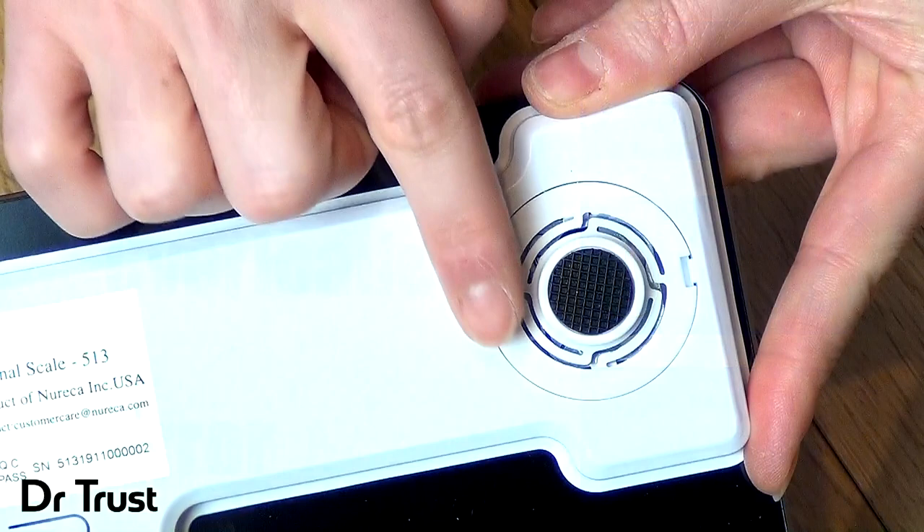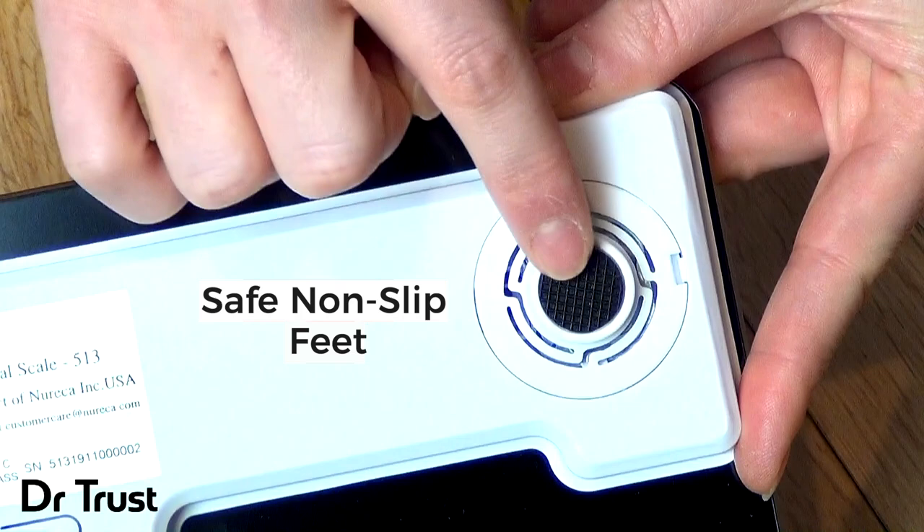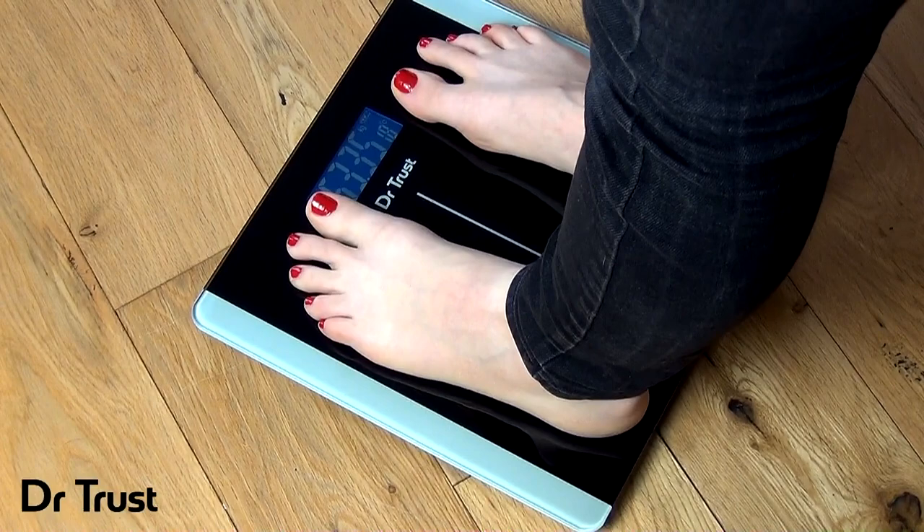The non-slip feet ensure that this scale remains steady on any surface for your safety and peace of mind, and there are full instructions on the back of the scale if you ever need a reminder or run into any problems. So, keep track of your weight with precision and style. Get your Dr.Trust Balance Personal Scale 513 today!